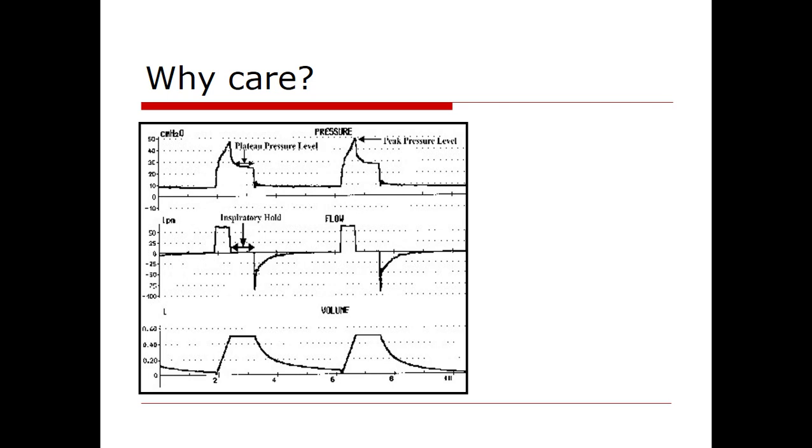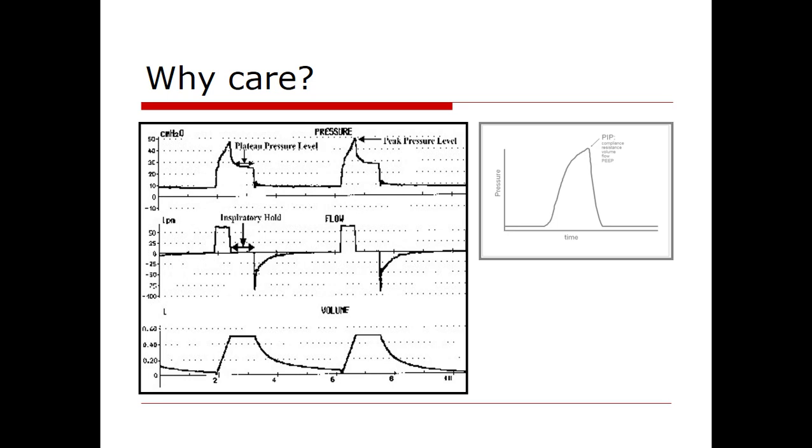And so I guess this is just another graph showing when you press this inspiratory hold, this is flow, the breath went in, it's held, and now it's coming out. So you get the peak pressure and the plateau pressure. The total peak pressure is due to a lot of things. The size of the tidal volume, the flow rate you sent it in, airways resistance, respiratory system compliance, all of those things can give you a high peak pressure.